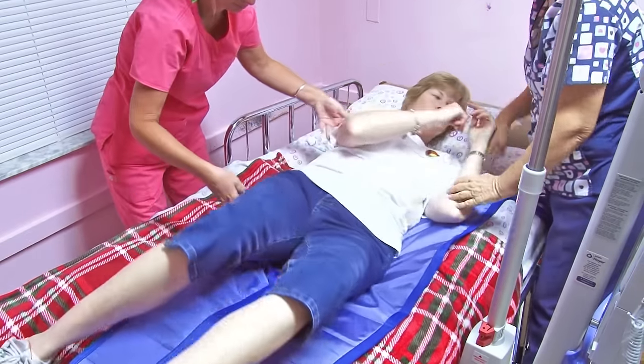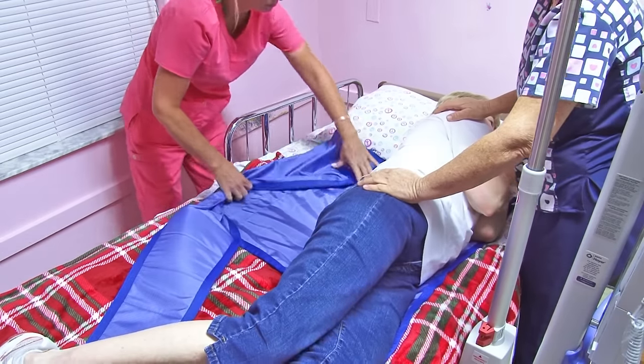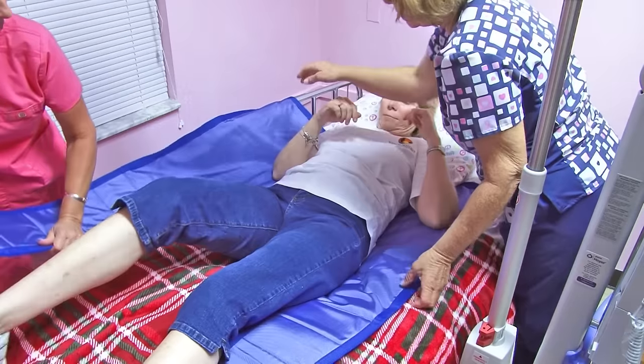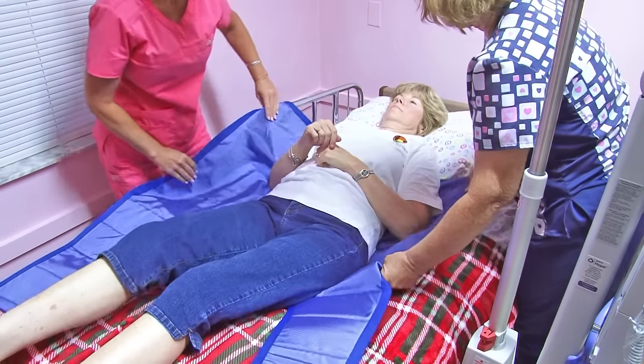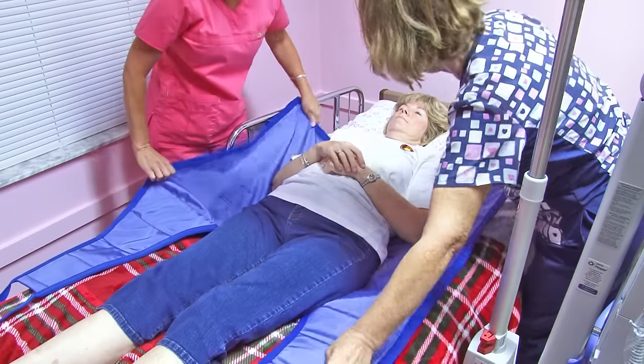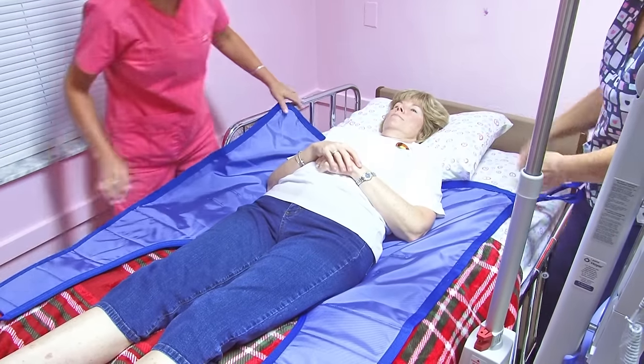Go back. I'll support you while you're that way. There you go. Now the resident is in the center of the sling.